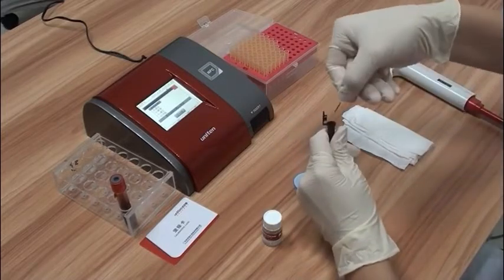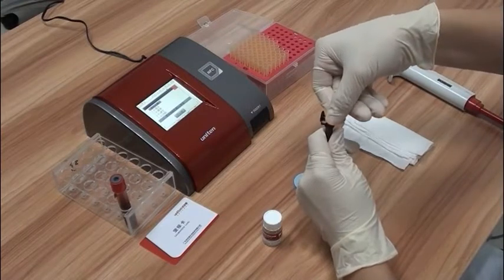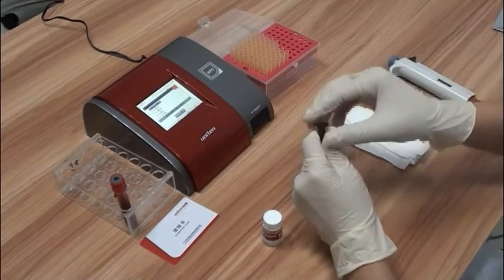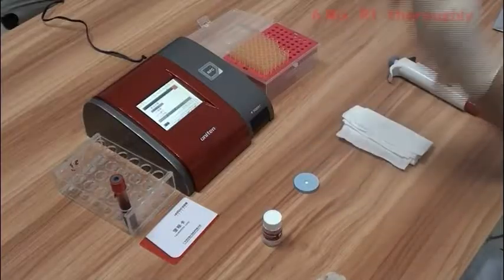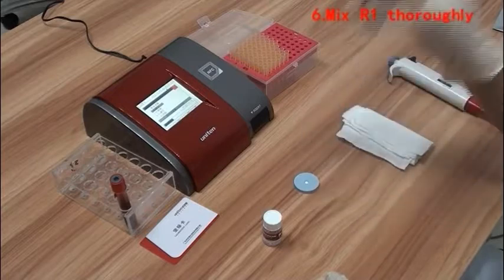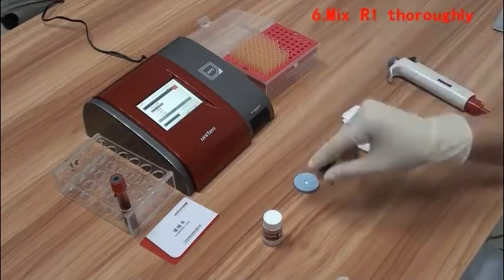Put the glass capillary tube with 5µL of blood sample into the R1 reagent test tube, then click next step on the screen. Shake the R1 reagent test tube along the vertical axis for 15 times to mix, following the voice guide.